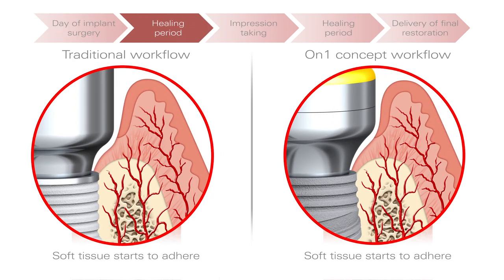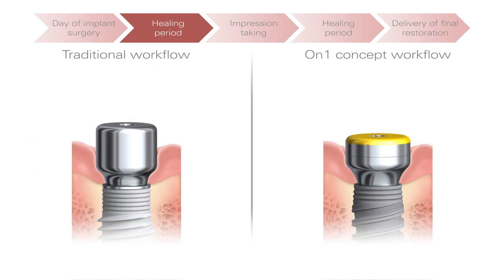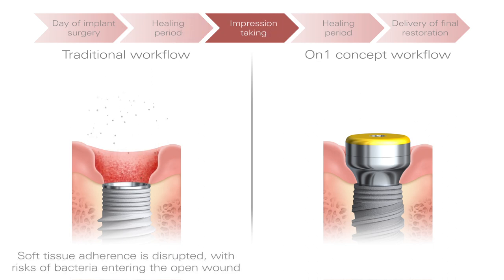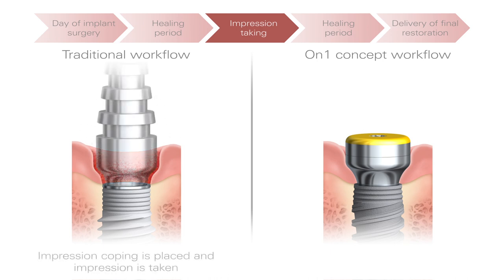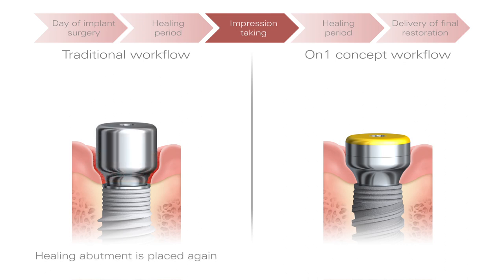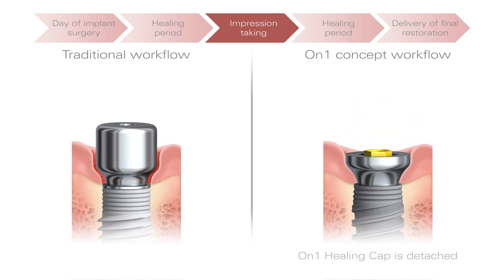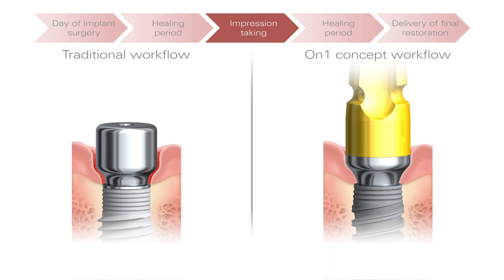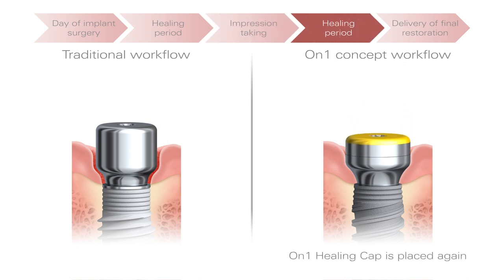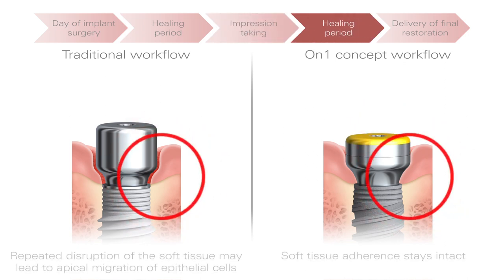The soft tissue naturally adheres to the biocompatible components. To take an impression in the traditional workflow, the healing abutment is replaced with an impression coping, which reopens the wound, risking bacterial invasion. Because the On-One base raises the prosthetic platform to tissue level, just the healing cap is removed for impression taking, and the soft tissue remains undisturbed.